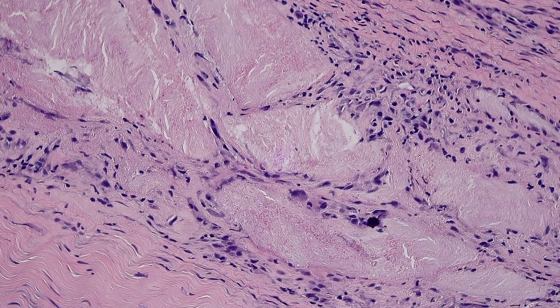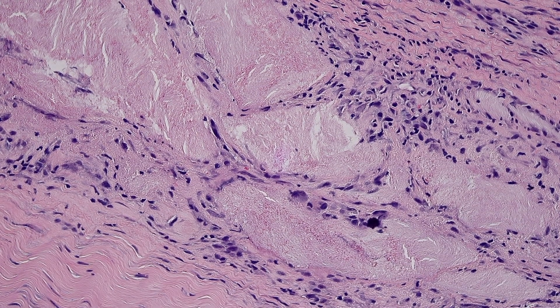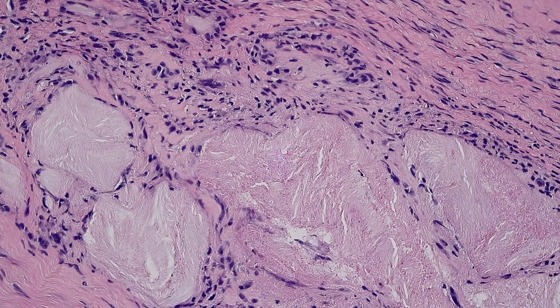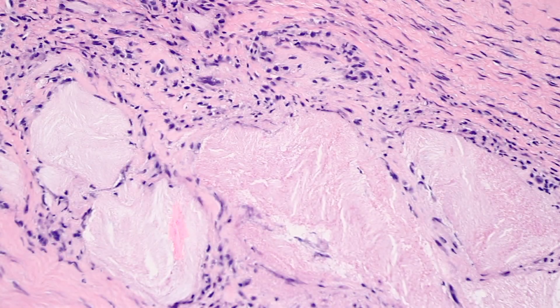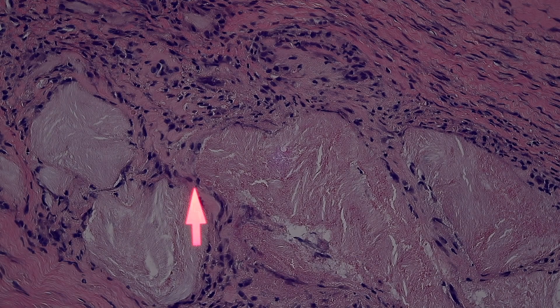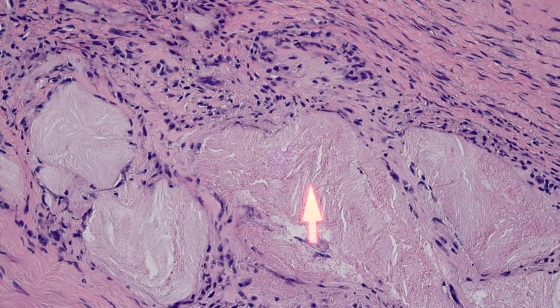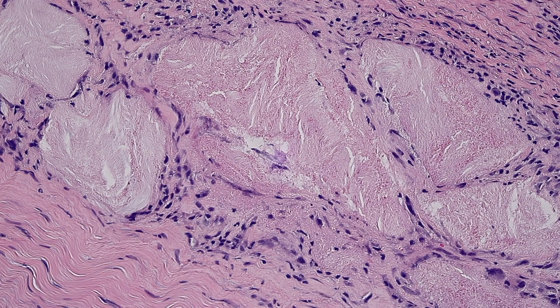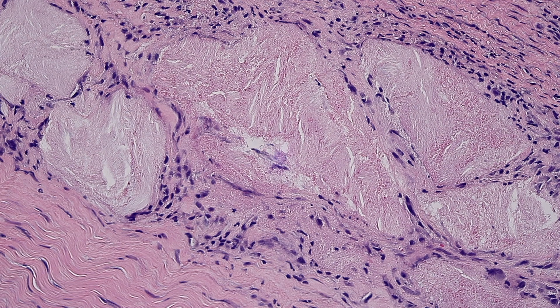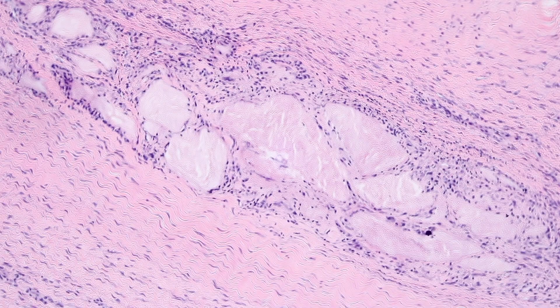There are a couple of giant cells there. The giant cells can be really purple and dark and so robust as to look scary for malignancy at low power. Here you can even get a vague impression — if I flip the condenser down — of maybe tiny needle-shaped spaces that might represent the urate crystals. As everyone learns in med school, monosodium urate crystals show birefringent polarizing needle-shaped crystals under polarized light exam.